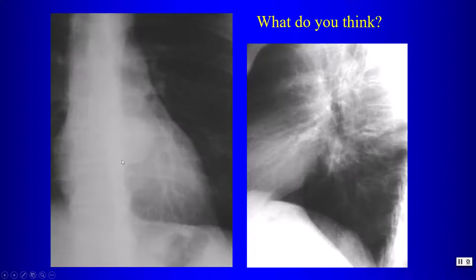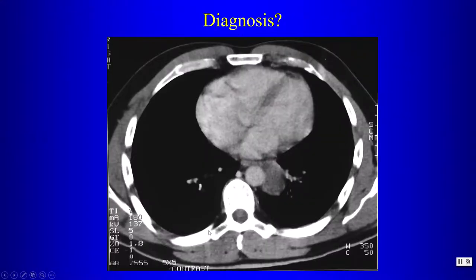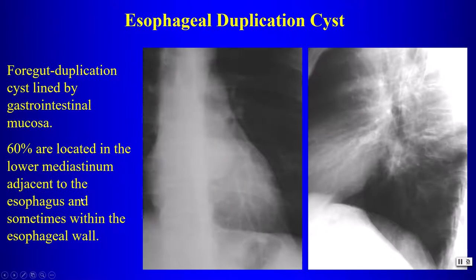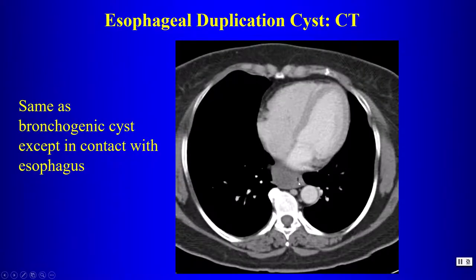Next case: a rounded lesion behind the heart, seen in the middle mediastinum on lateral view. On CT it is fluid attenuation but is located somewhat lower than a typical bronchogenic cyst and is in contact with the esophagus — this is an esophageal duplication cyst. Esophageal duplication cysts are foregut duplication cysts lined by gastrointestinal mucosa, located in the lower mediastinum adjacent to or within the esophageal wall.